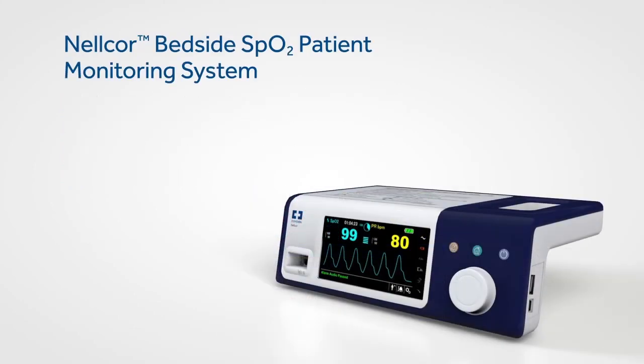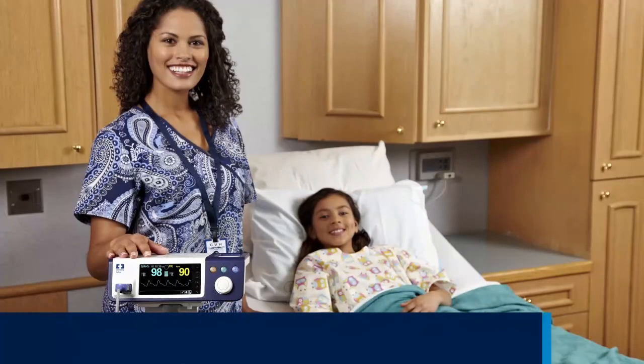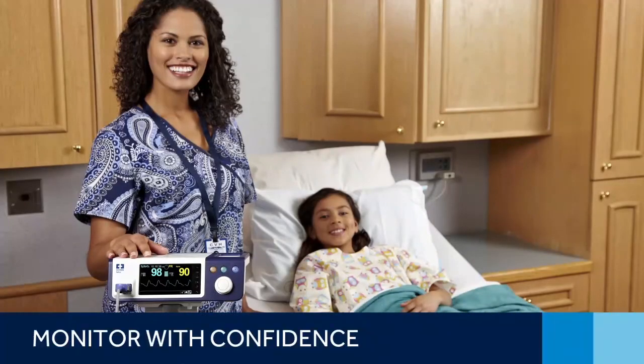With its easily accessible features and user-friendly interface, the Nellcor bedside SpO2 patient monitoring system makes it easy to access critical patient information. Clinicians can feel confident in the ability to detect respiratory complications earlier and intervene sooner. It all adds up to better patient care.